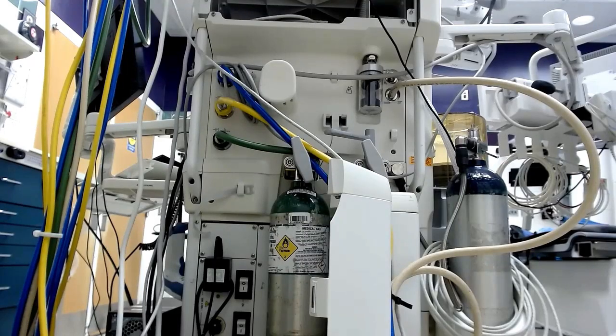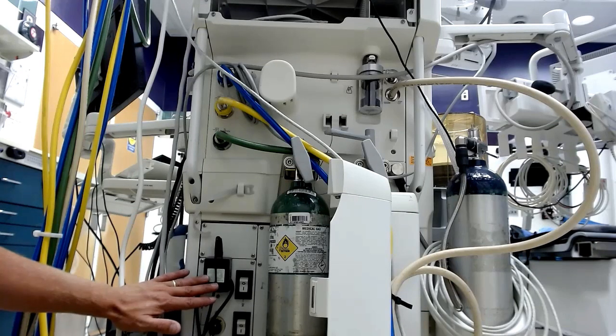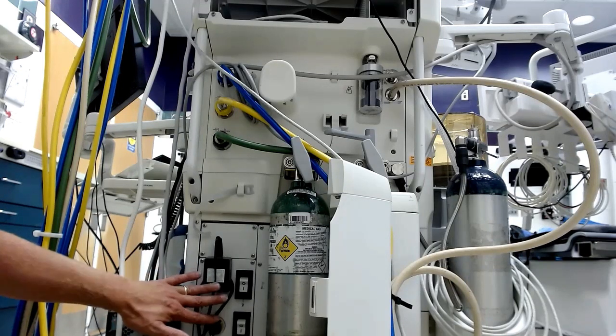So this is the back of an anesthesia machine or an anesthesia workstation. As you can see, there's a lot going on back here. We're going to look in generalities of some of it, and then I'll try to zoom in. But what you'll see here on the bottom part is you'll see plugs and you will see circuits.